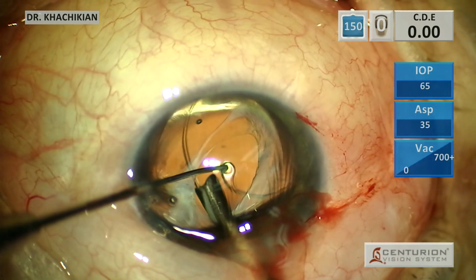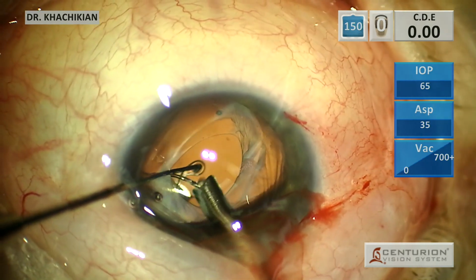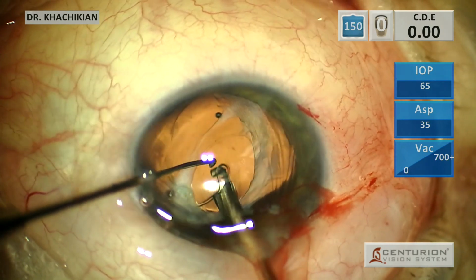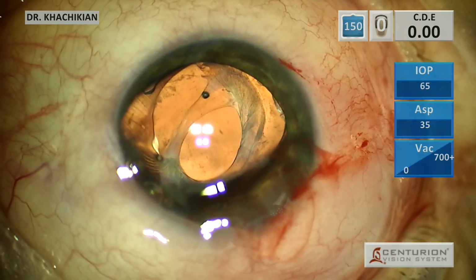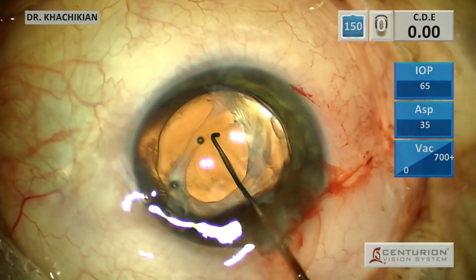And there you go. It pivots around the Sinskey, goes right in, and then expands. In a routine cataract surgery where you don't have an injector, you can really just place the capsular tension ring manually, hand over hand.